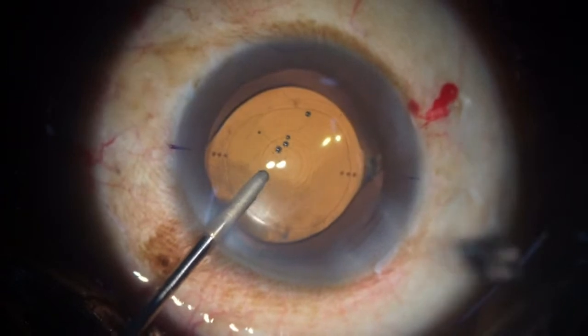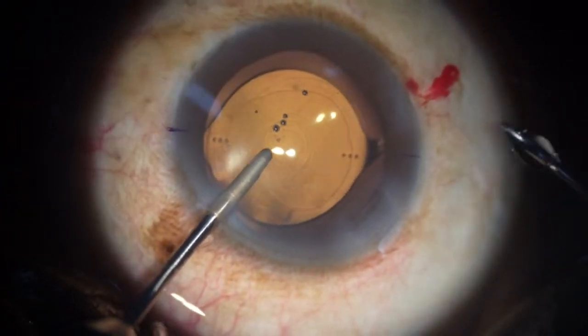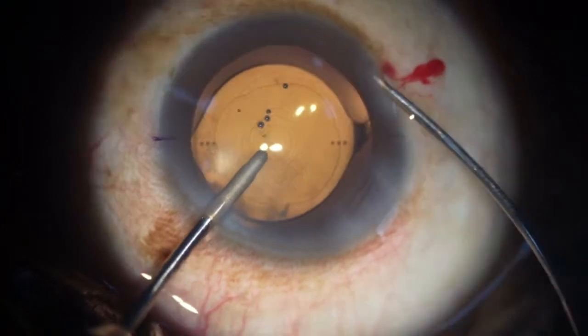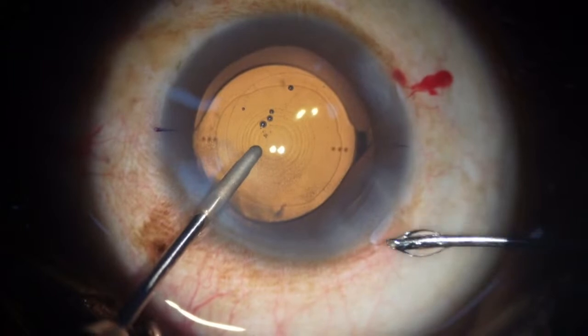And now my infusion is on. My chamber is well formed. There is no fluctuation in the chamber. And using my left hand to support the globe, see, I can support the globe very well. And my chamber will remain stable throughout. I'm going to hydrate first the one side port, and then my main incision.